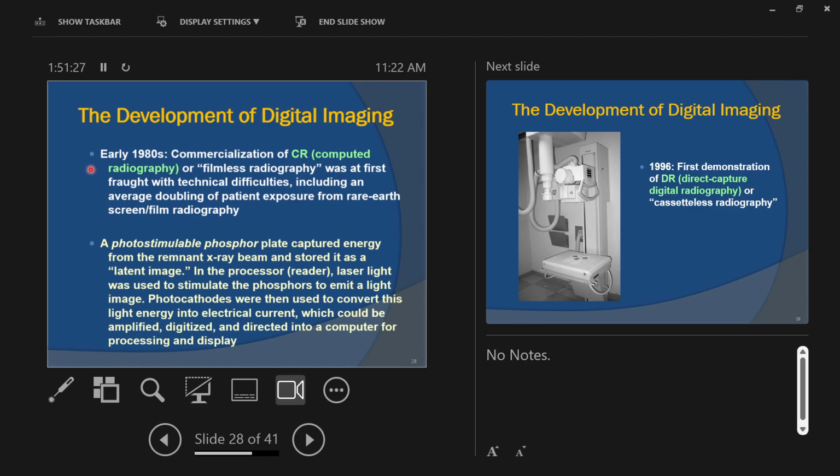which is why, by the way, it was really common back in the film days to take more than one exposure on a piece of film, to have multiple exposures on that same piece of film. It's also why the x-ray techs who are older and train you sometimes have you put multiple images on a piece of film. It was one image on the computer screen, right? But it's an old way of saving film from back in the day.